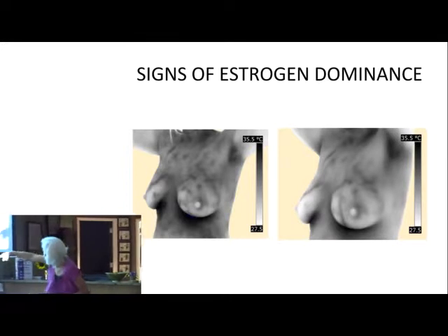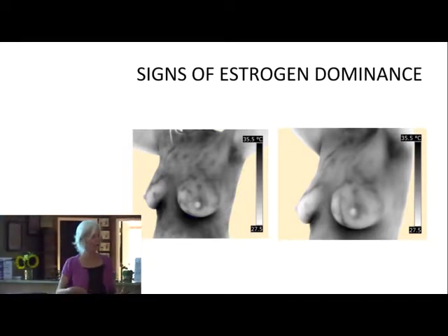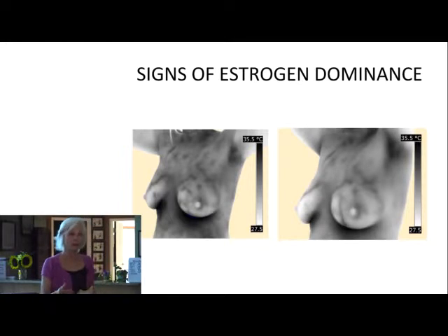Can you see in her image there, this grayscale, how it's kind of polka-dotted looking? There's kind of like spots. You see that? That's the sign that she has... Have you ever heard the term estrogen dominance? Estrogen dominance, okay. Hormonal imbalance factors into reproductive health, including breast health. So hormones can contribute to increased risk.